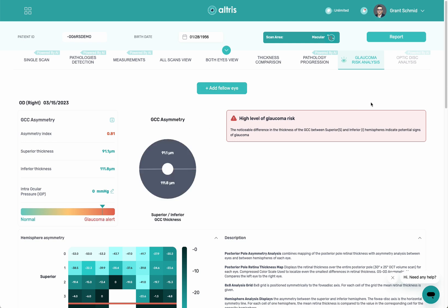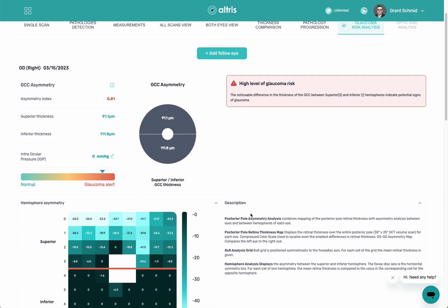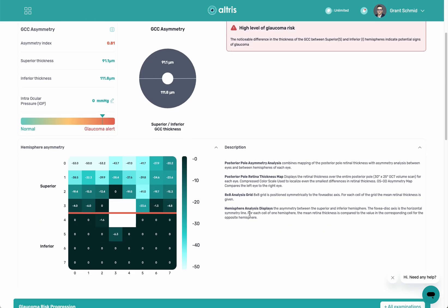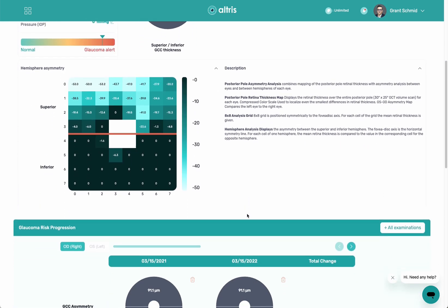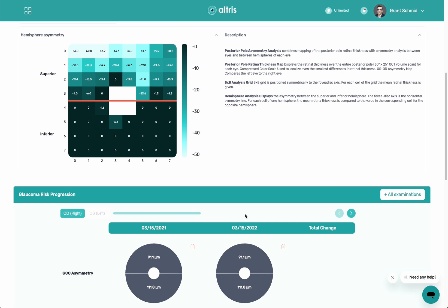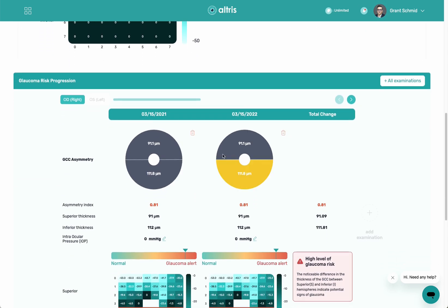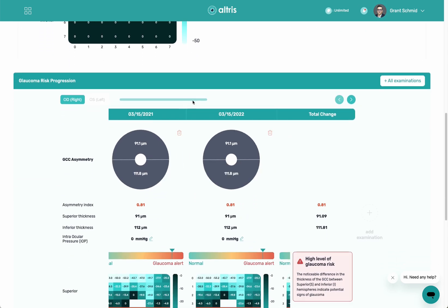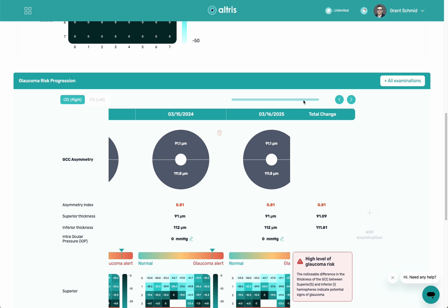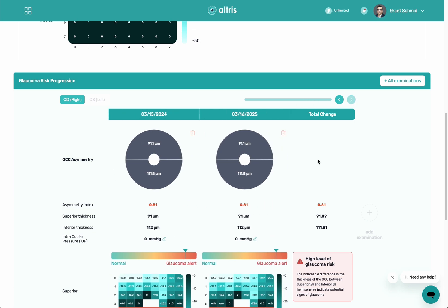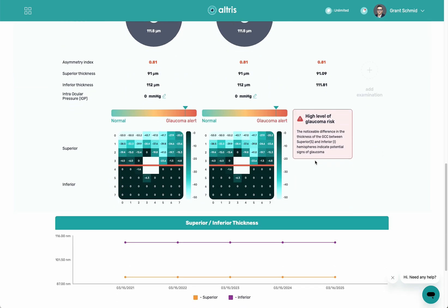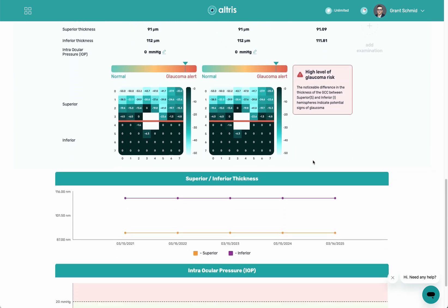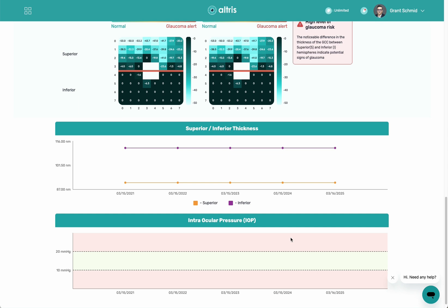I can add an additional eye right here if I want to look at two eyes side by side. You can see a glaucoma alert. As I look down here, I can see additional information, as well as look at multiple exams over time — looking at glaucoma from a macular perspective. I also have the ability at the bottom to add in IOP pressures and graph those to correlate.